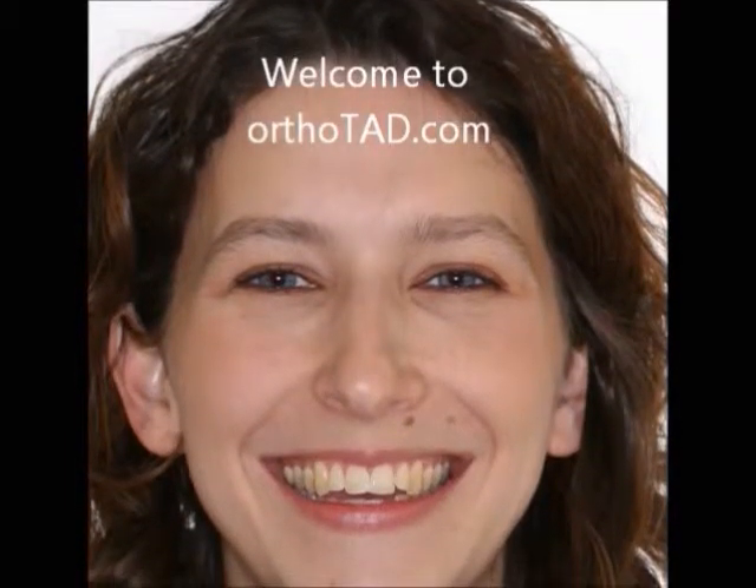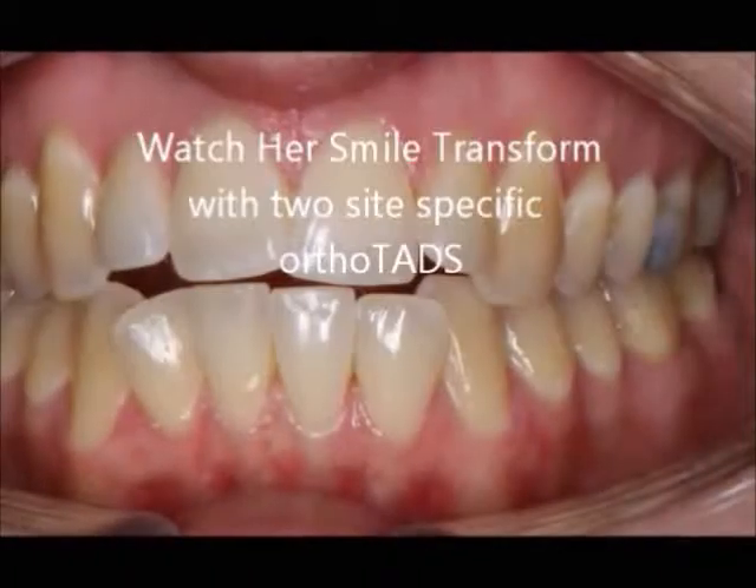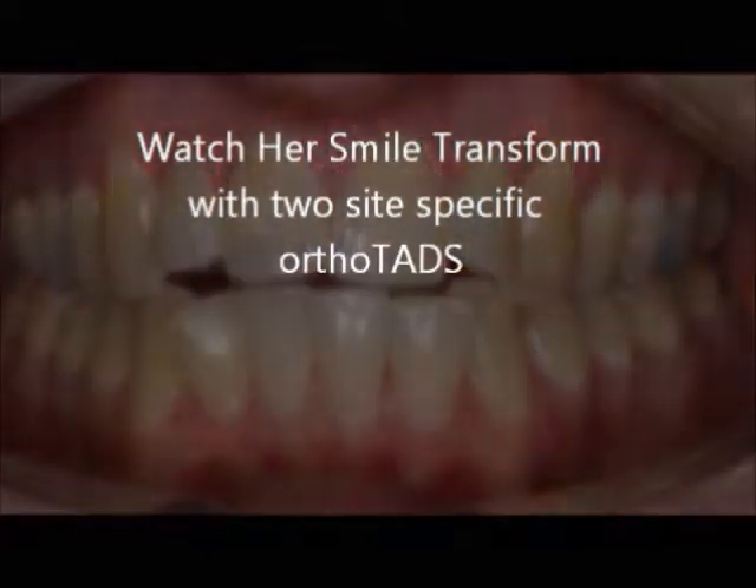Welcome to Orthotad.com. Watch her smile transform with two site-specific Orthotads.